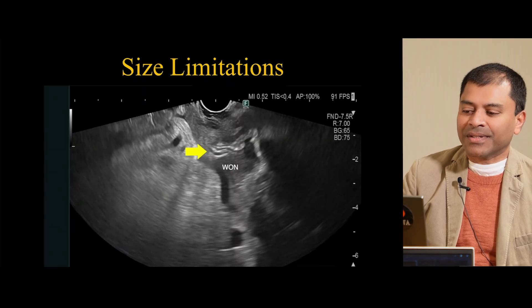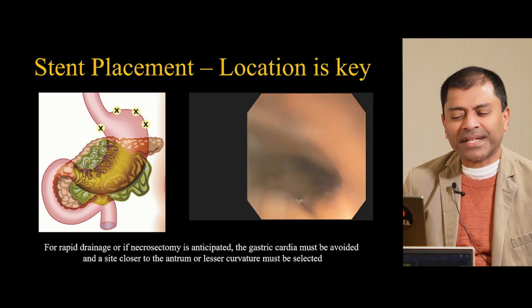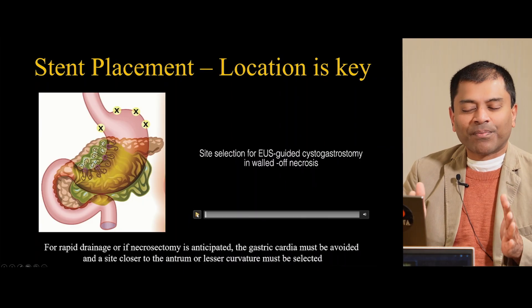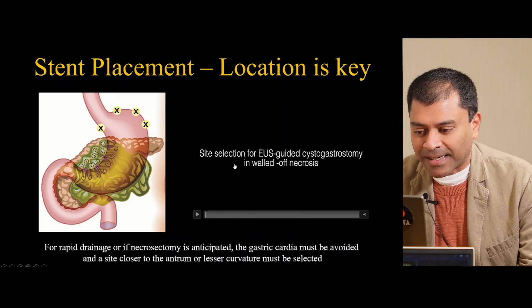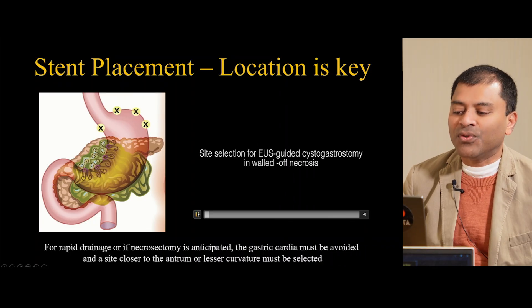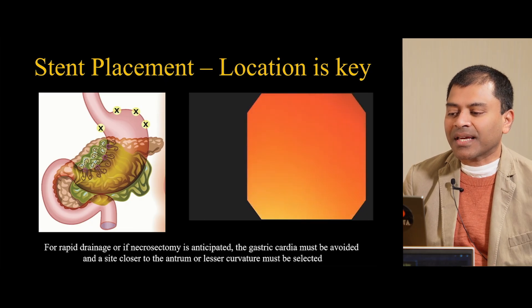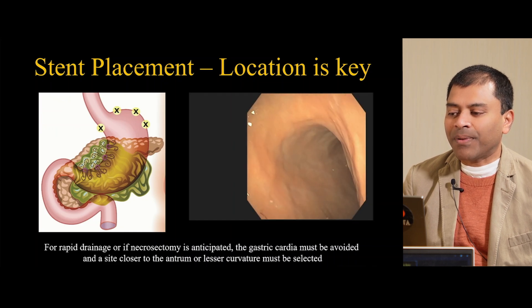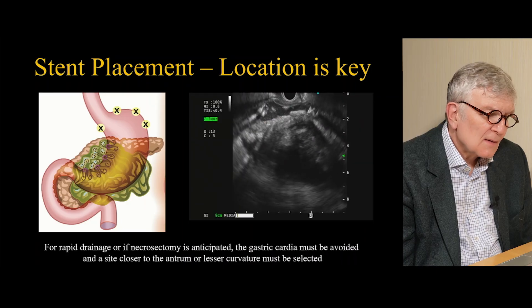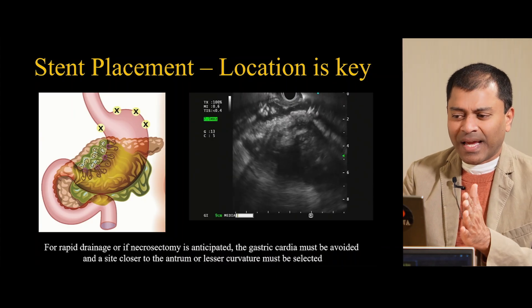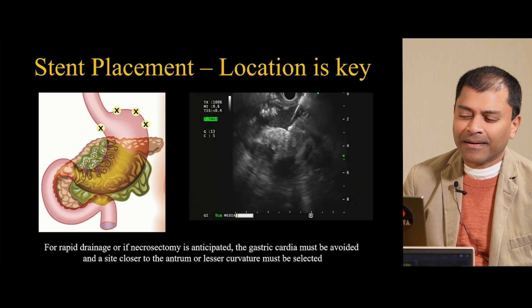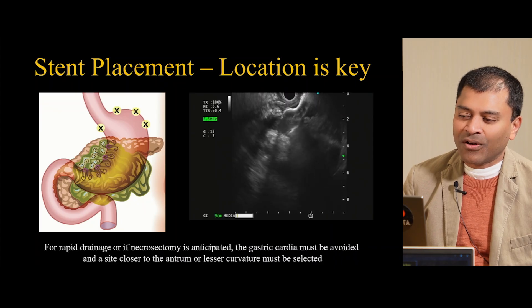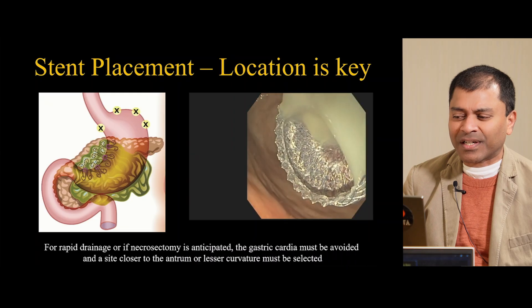We can show you where a stent should be placed. All those X marks are places where one should not place a stent because it gets very difficult to access them. This video shows the most ideal location for collection access. This is a patient who comes with a fluid collection. You start at the GE junction, suck air, advance your scope down, and start seeing necrosis. Going towards the pylorus, you start seeing luminal compression on the stomach. Retracting the scope, that's exactly the place to deploy — midway between the esophagus and the pylorus — giving a lot of scope stability for an endoscopic necrosectomy at a later time.